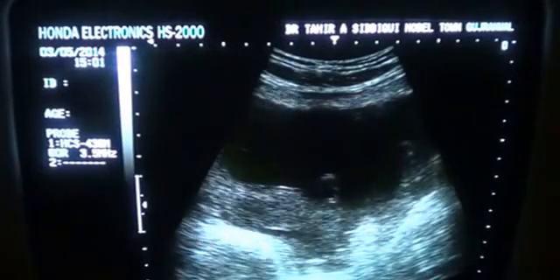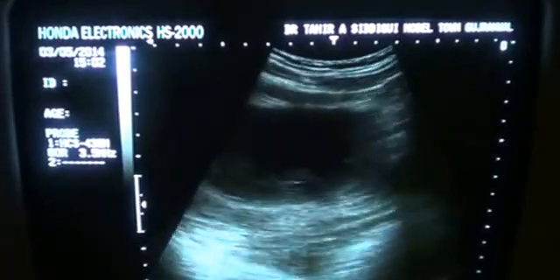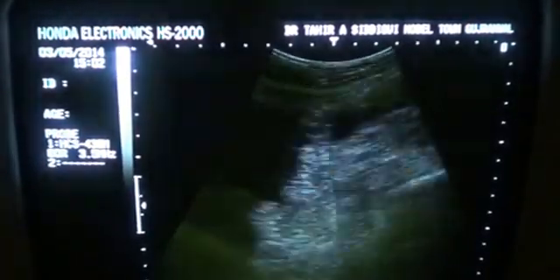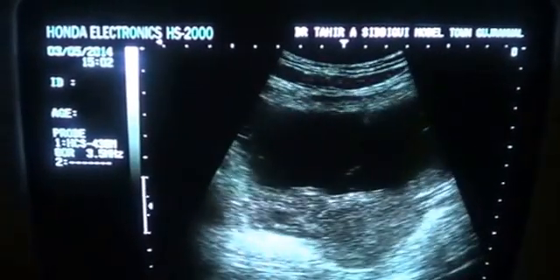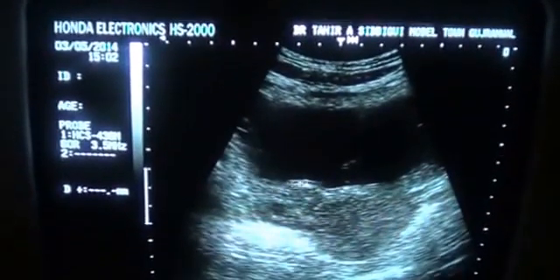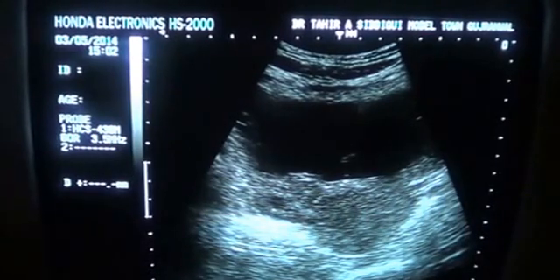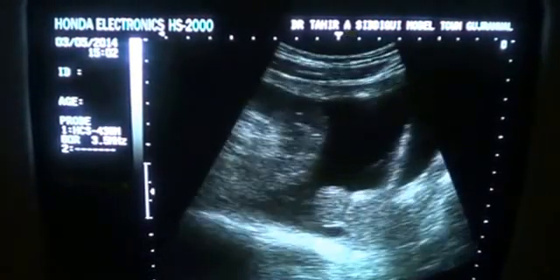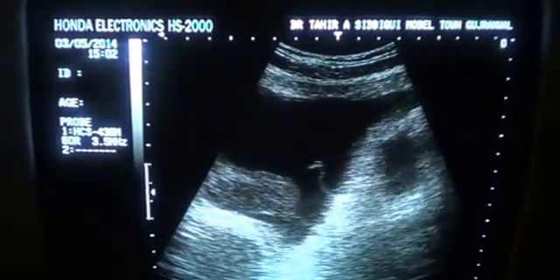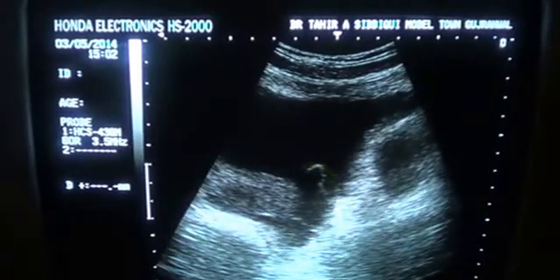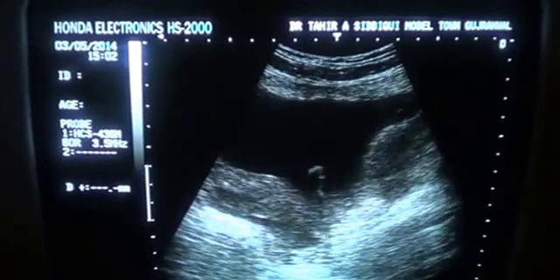In transverse section, you are seeing again the fluid. This is the uterus in transverse section and this is the ovary in transverse section — this is the fluid. And you can see a dancing septal — this is the septal, an incomplete thin septal. You will see debris in the dependent region. This is debris.